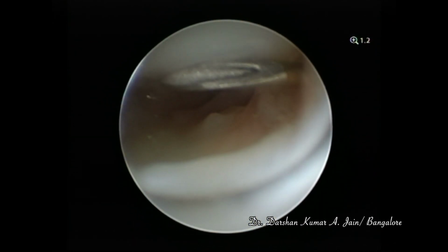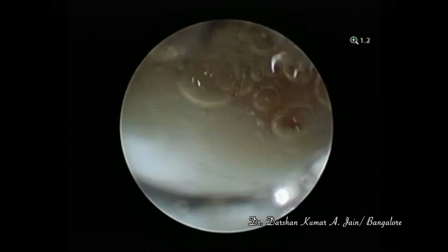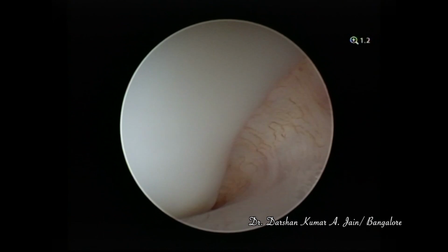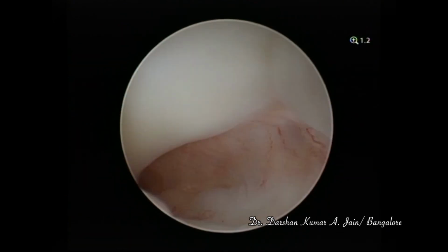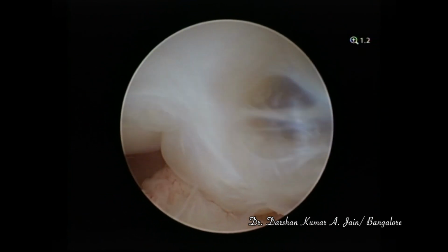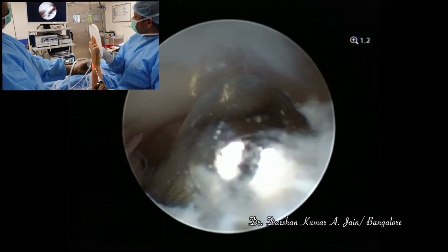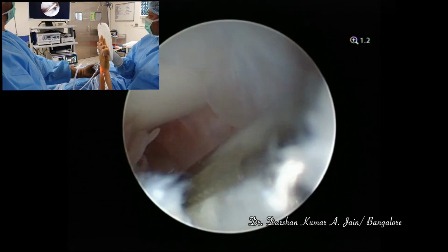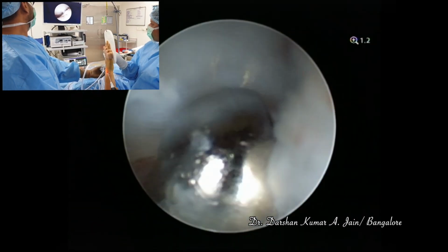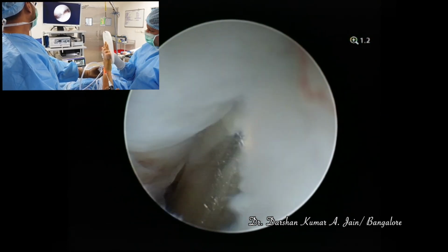Now we are making the 6R portal. The normal saline is used to distend the joint. Now we can see the cyst better, and there's a lot of synovitis as well on the dorsal capsule, which is shaved off. A small joint shaver is preferred for these procedures.